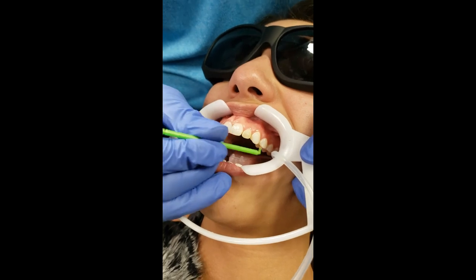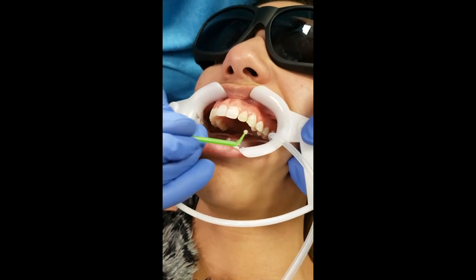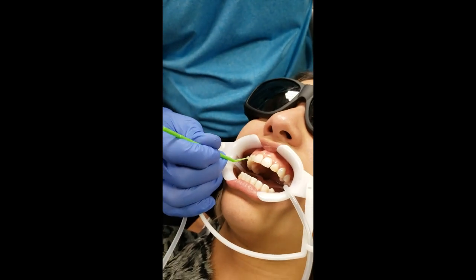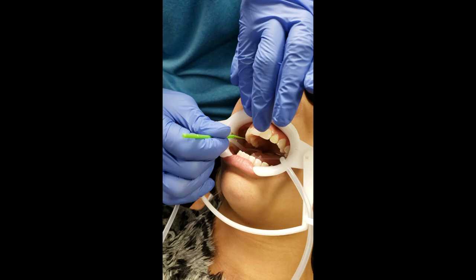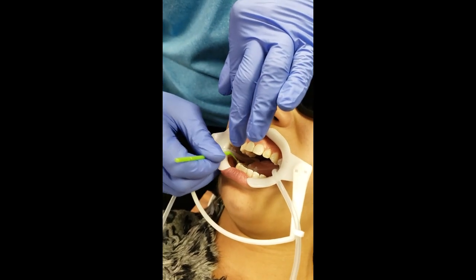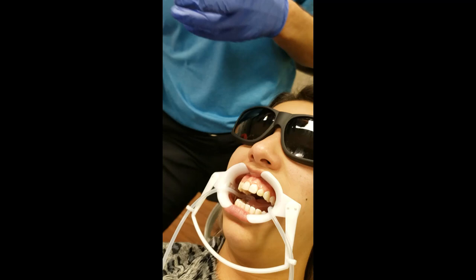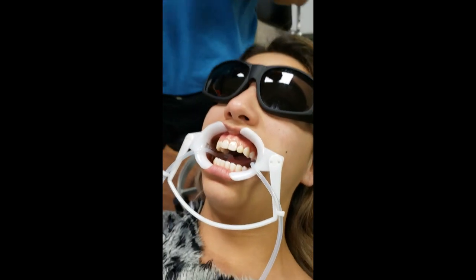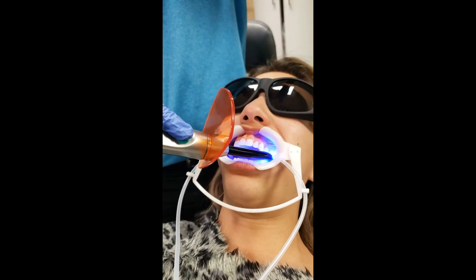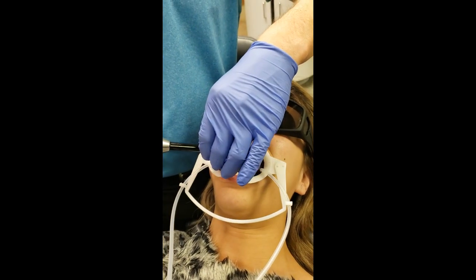Just a little coat here and a little coat there. I say this all the time - you only need one tiny drop of primer to do an entire arch of braces, so for this where you're doing six teeth it should be plenty. You also want to coat the appliance in case it happens to dry out while sitting under the light. I like to light-cure this briefly - it's not strictly necessary, but it prevents the appliance or bracket from sliding around as much. Let's do a one-beat cure just to let it set up a little.